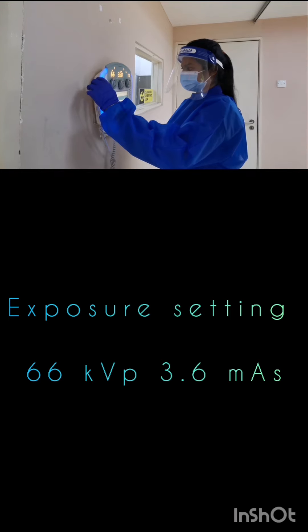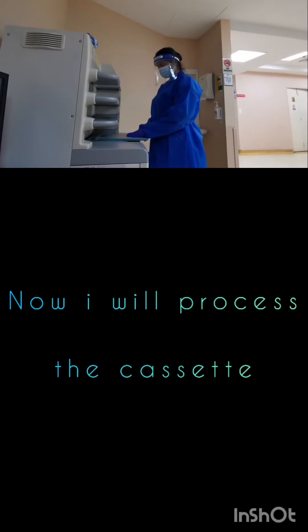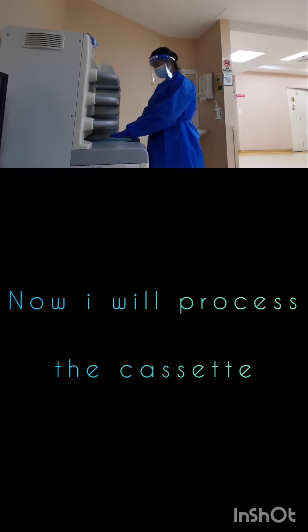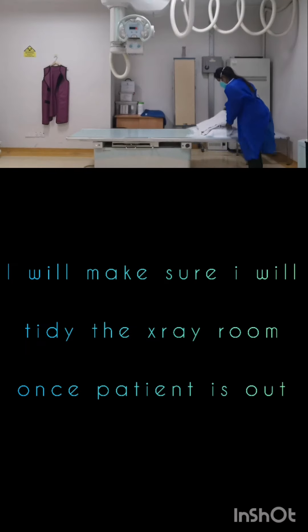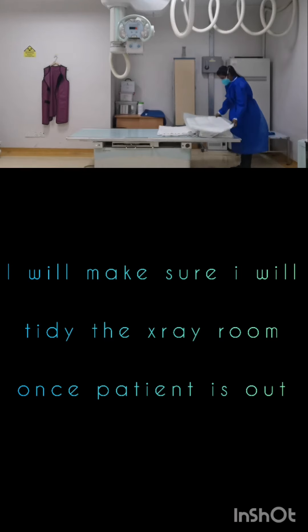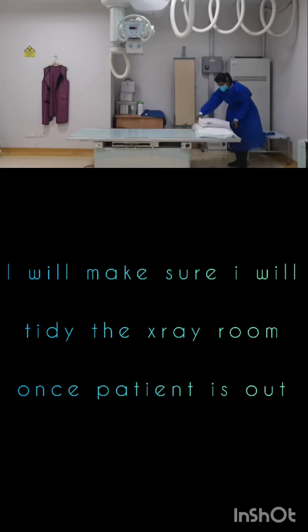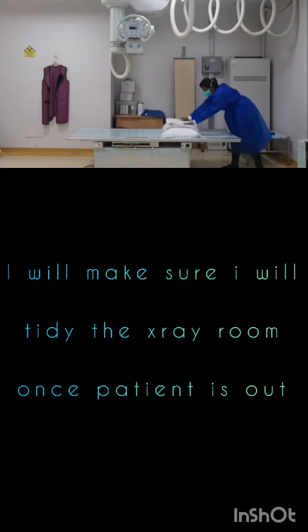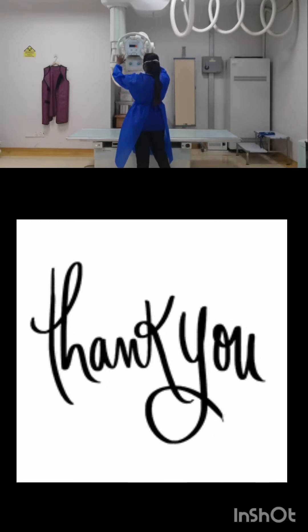The exposure setting for this projection is 66 KVP and 3.6 MAS. Now I will process the cassette. After the patient is out of the room, I will tidy the x-ray room so that for the next projection or next patient, the radiographers will find it convenient to perform the x-ray.